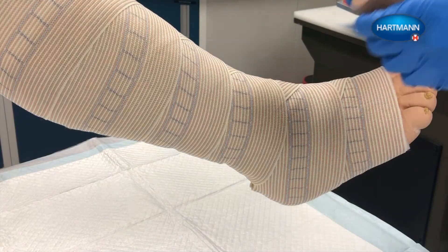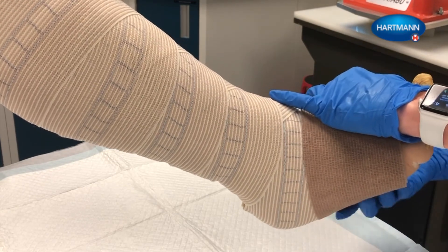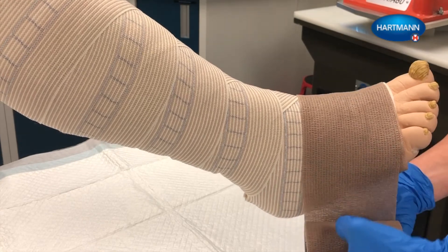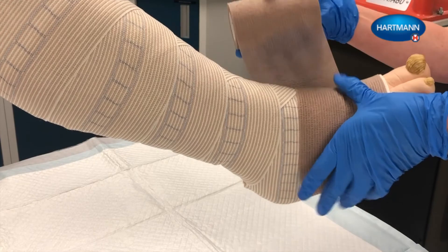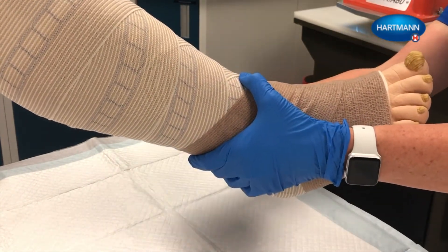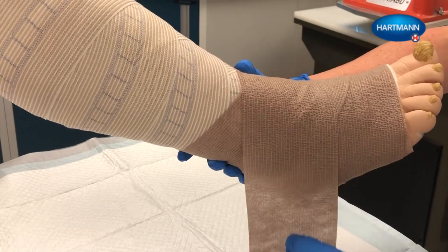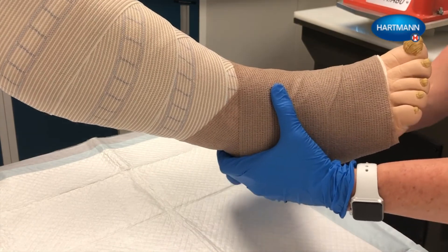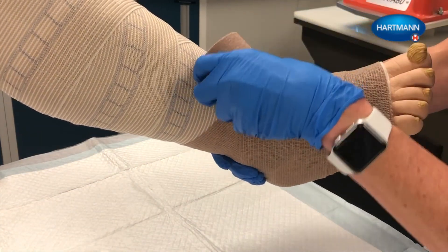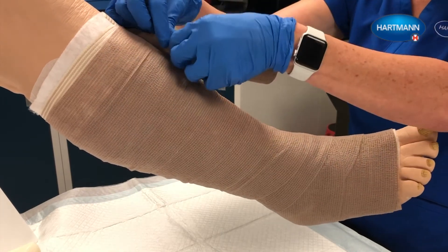Layer 3 is the cohesive compression bandage. Start wrapping the cohesive compression bandage proximal to the base of the toes. After 2 turns for fixation, wrap the bandage across the back of the foot and then enclose the heel. Using a spiral technique at 50% extension with 50% overlap, continue to wrap the leg to just below the knee. Cut off any excess bandage to avoid a tourniquet effect once you have wrapped to the knee.